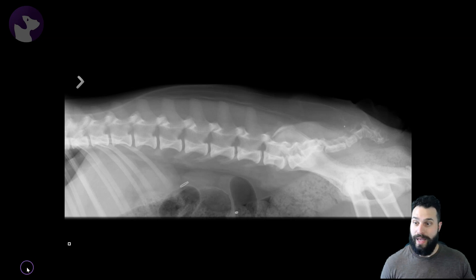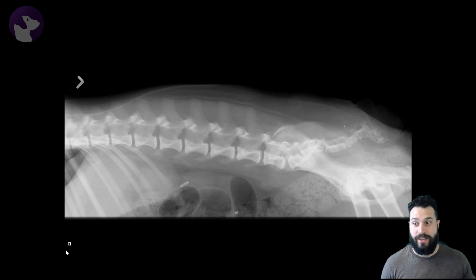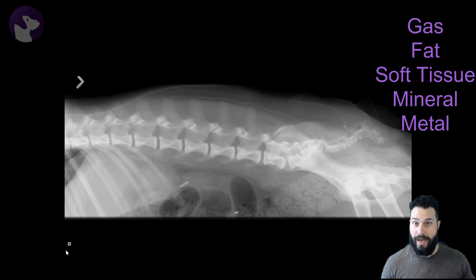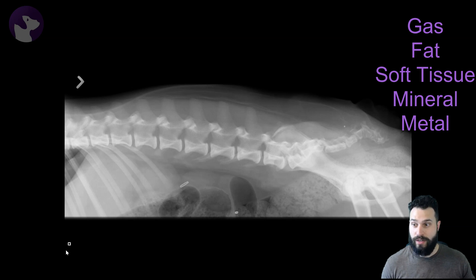What we end up identifying is a range of opacities that extend from gas to metal. Gas, fat, soft tissue, bone, and metal are our radio opacities. We can identify all of them in this lumbar radiograph of the dog.